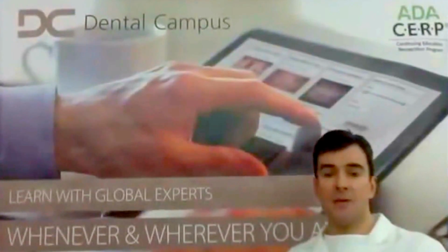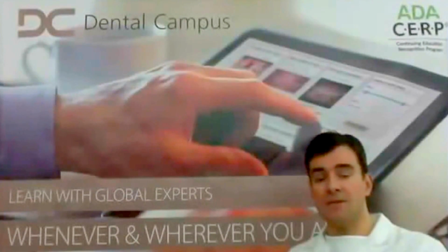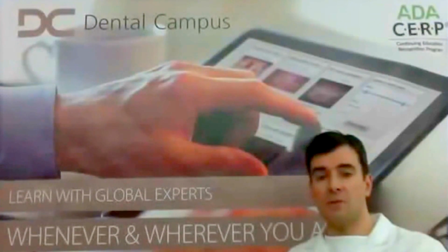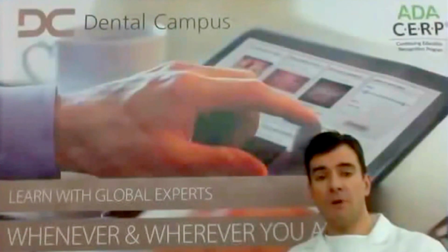But anyway, today I think it's really important to try and compensate for the missing information, and we can do this by carefully performing a palpation or bone mapping. You can use a periodontal probe or an endodontic needle to do some kind of mapping of the bone. This can even be done by sectioning the models.